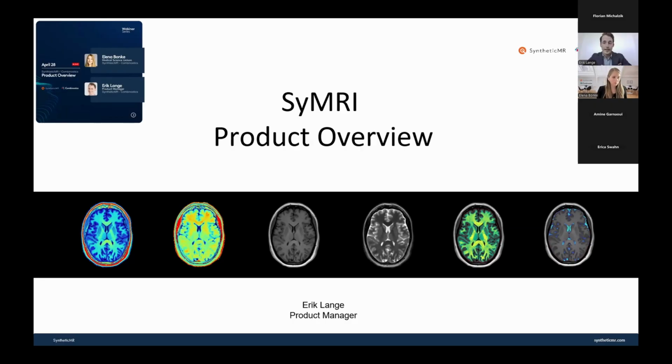My name is Erik Lange, and I'm the product manager at Synthetic MR. And in the next 20 minutes, I will show you 3 things. Firstly, I will briefly describe what SyMRI is. Secondly, we will look at the different outputs that SyMRI can provide. And lastly, I will briefly show 3 different areas where this can be applied in your clinics today, hopefully giving you some ideas on where this can be relevant for you and your colleagues.